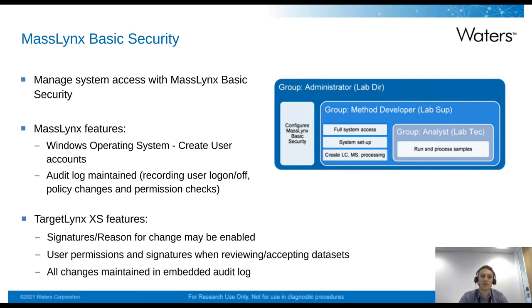All actions that are then performed in MassLynx are tracked, with an audit log being maintained. TargetLynx also has features to require signatures and reasons for changes to integration, for example, and signatures for reviewing and accepting data sets.